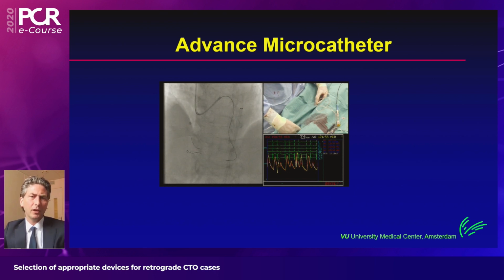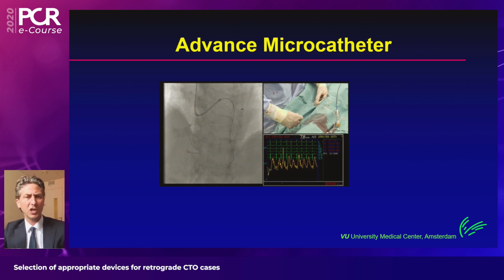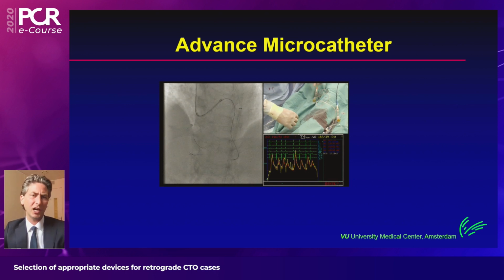And you can see that the Corsair Pro right now is stuck at the base of the heart between the junction of the septal and the PD, but it's often just a matter of building up torque and tension and just waiting a little and giving it time.